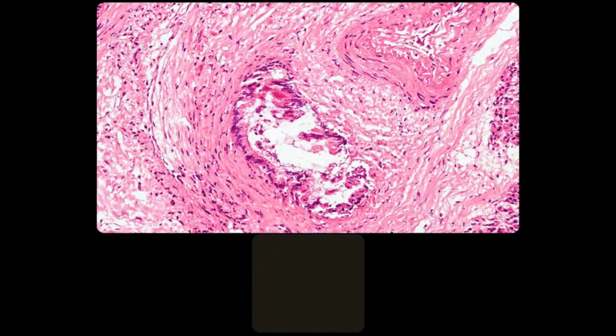So these are the real live situations, and I'm just showing you areas that you will sometimes get as the only representation of the lesion. And this actually is a pancreatic adenocarcinoma, because if you start to look really carefully here, despite the frozen artifact, you're starting to see nucleomegaly, pleomorphism, a degree of luminal debris. And as I said, when you get an isolated odd gland next to a vessel, your index of suspicion for adenocarcinoma is heightened. This is a higher power of the same. Again, you'll appreciate the nuclear features and a bit of debris.